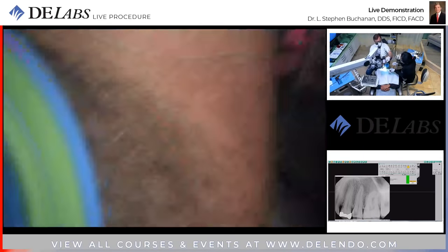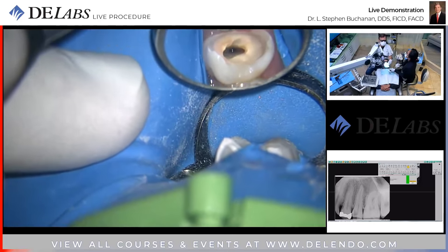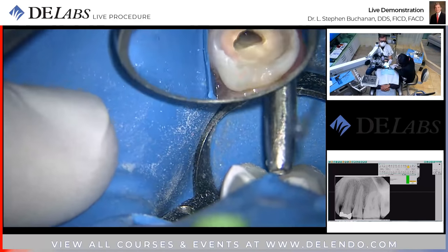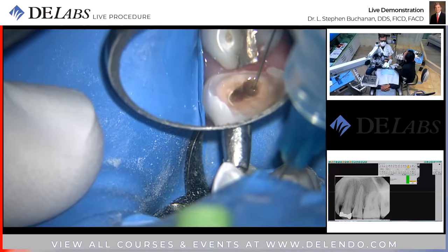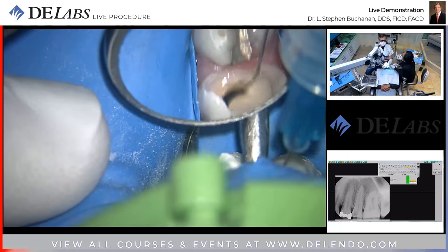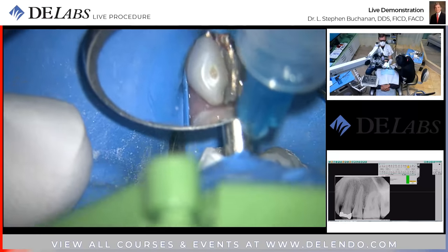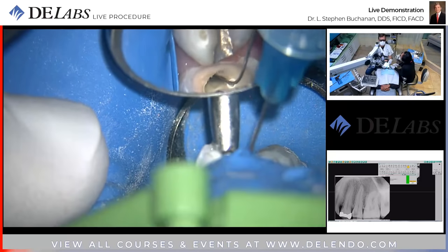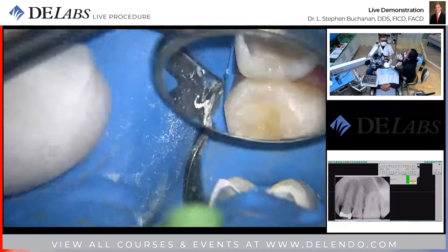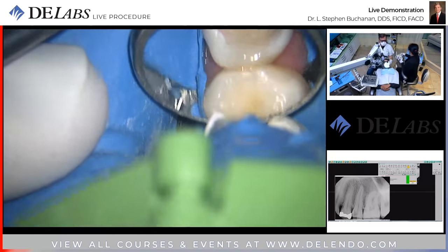Let me get my microscope set up in the right spot. Interesting. These canals and pulp chambers look so clean. Now you will get particulate matter up out of a primary canal, especially a big one like this. It's interesting. The sound energy hugs the dentin wall of the canal and actually works less on the tissue in the center of the canal than it does on the tiniest apical lateral canals. Let's try paper points and see what this is going to dry like.